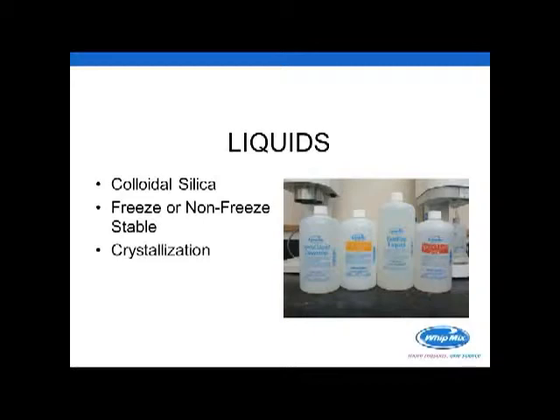And what that means to you is that if this material gets to the point where it does freeze, it will reconstitute. Now, most of you are familiar with freezing milk. If you freeze milk, it separates. The water freezes up first, the solids go out, freeze second, and then it's really difficult to get it to reconstitute. It's never quite the same. And the same goes with those liquids that are non-freeze stable liquids.